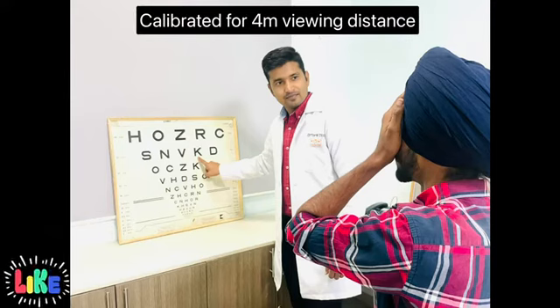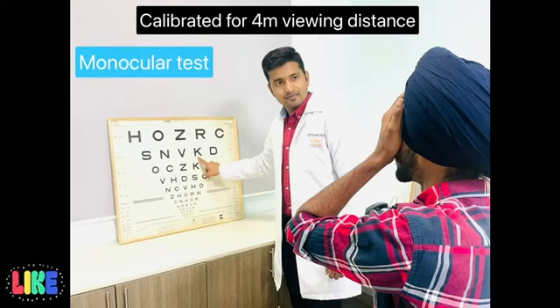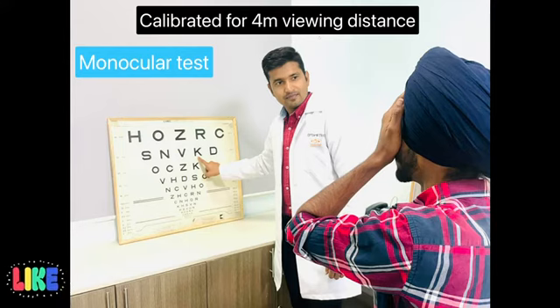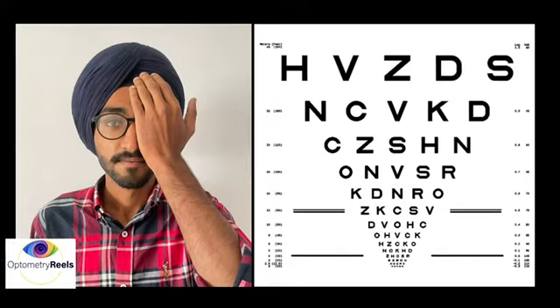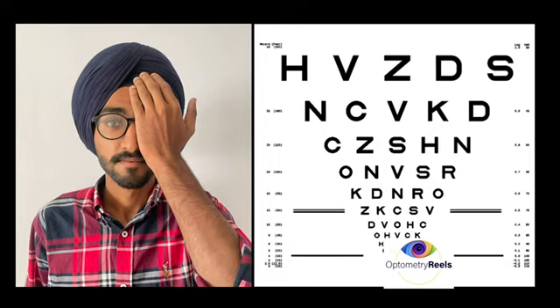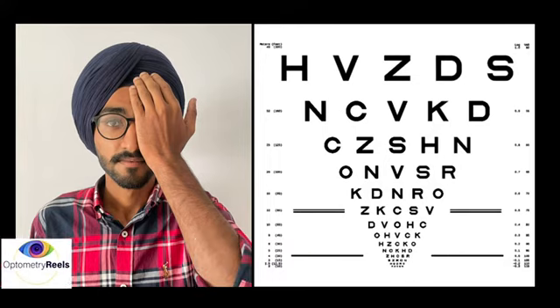In general, the distance LogMAR acuity charts are calibrated for 4 meters of working distance. Since it is a monocular test, hence each eye should be tested separately. You can also perform the test with or without glasses.